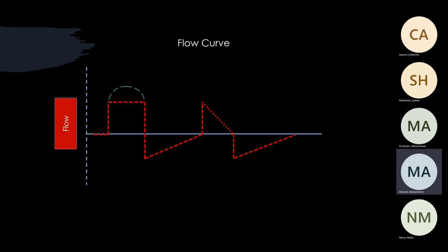The one that is close to normal, like you and me right now, talking and doing everything, is the decelerating flow, not the constant flow. So then, why do we do constant flow? The constant square flow is mainly for patients like an ARDS patient, where you would like to control everything and get a good measurement of your stress index, your compliance, your plateau and everything. It's better to be taken in a constant square flow.